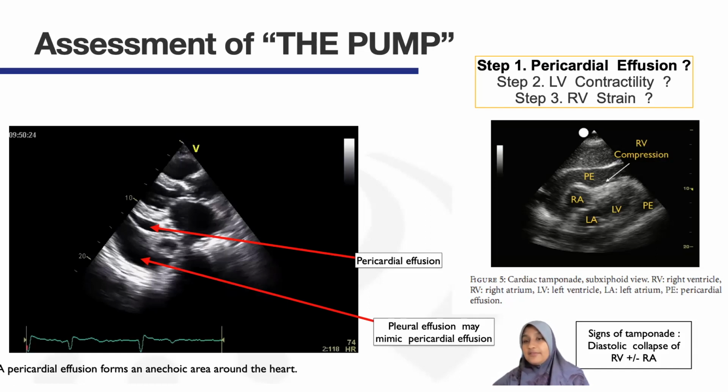Left atrium as well as left ventricle. There's still a bit more pericardial effusion here. So if the patient presents with hypotension with pericardial effusion, then it helps in your diagnosis of cardiac tamponade, and the patient needs to have the pericardial effusion drained as fast as possible.